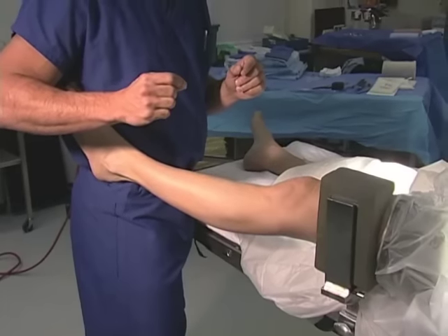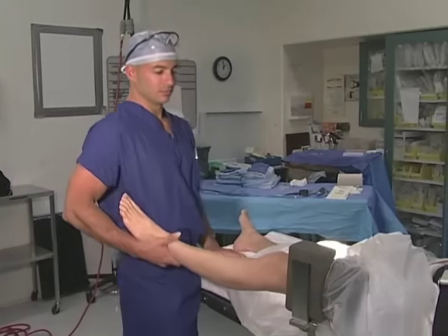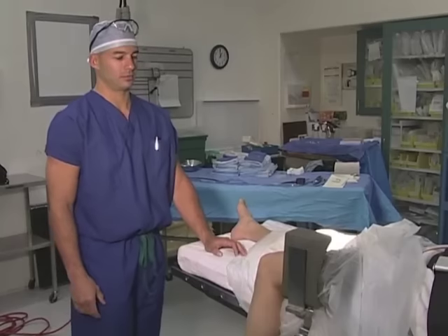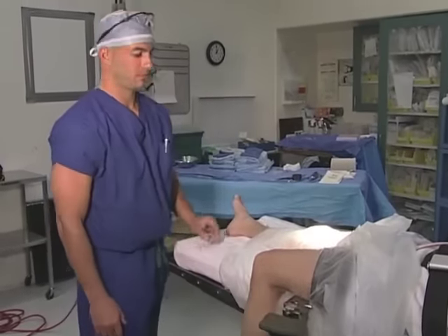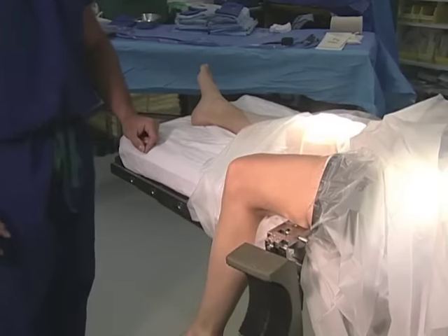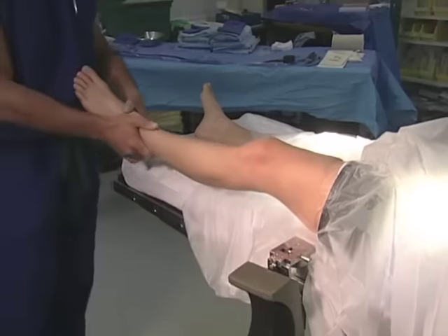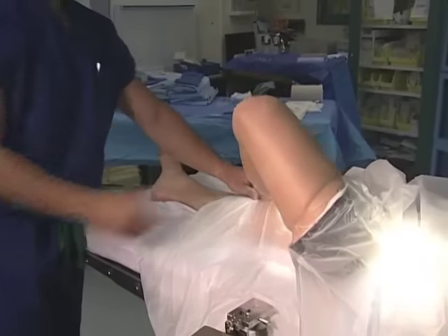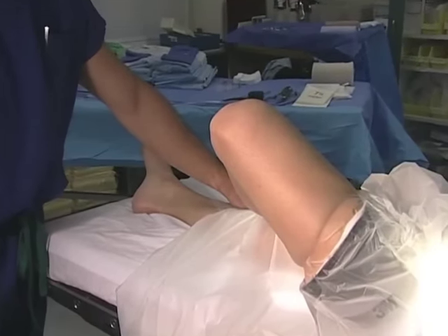After medial compartment arthroscopy is completed, the surgeon bends the knee off the end of the table and the post may be lowered. This allows arthroscopy of the intercondylar notch. The surgeon takes the ankle and rests it across the contralateral leg with the knee bent to 90 degrees, and sometimes applies pressure on the knee.